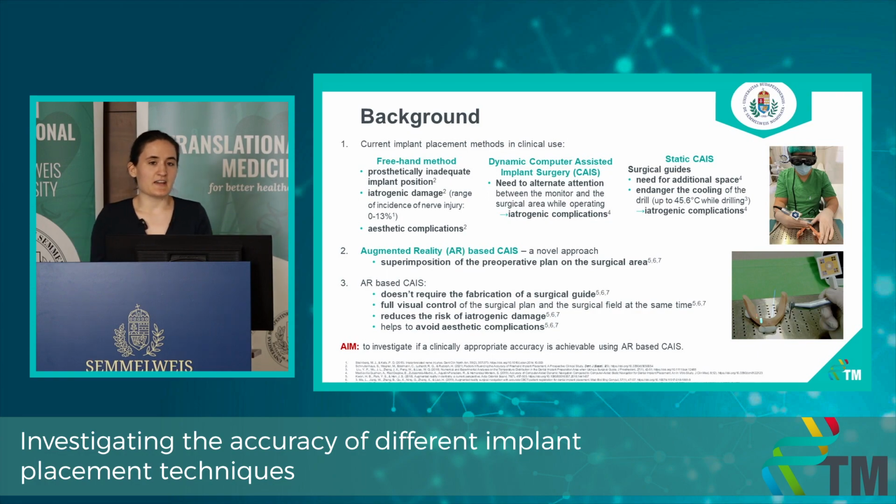So currently we have three more spread out implant placement techniques in practice. First one is the freehand method. However, it has some drawbacks like prosthetically inadequate implant position, iatrogenic damage, and aesthetic complications. Meanwhile, we have also dynamic navigation techniques, which force the surgeon to alternate their attention between the monitor and the surgical area. And we have guided surgery with surgical guides that need additional space and may endanger the cooling of the drill.